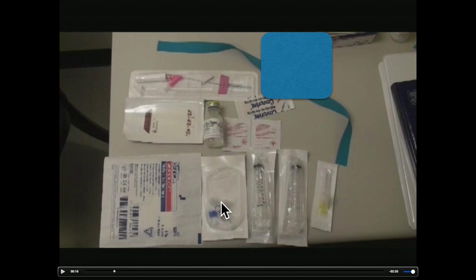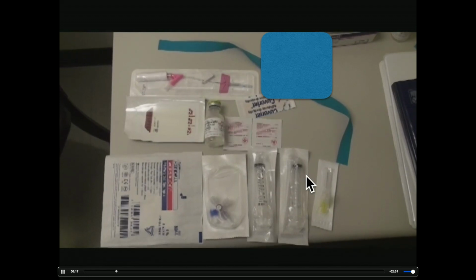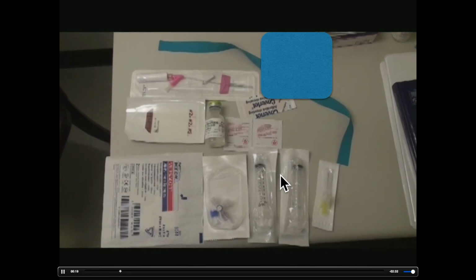And I think it's very important that you have the same protocol, and I have used the same supplies for the last 20 years, and this is what gives me accuracy on the protocol that we'll talk about, each different piece, but very important, I'm using the same needle, antecubital, 10 cc syringes, saline. And again, you can put this together. You don't need to have your own IV starting kit. It is a little bit cheaper when you just buy all these parts individually. So I'm going to connect now the two 10 cc syringes to agitate them and get ready.